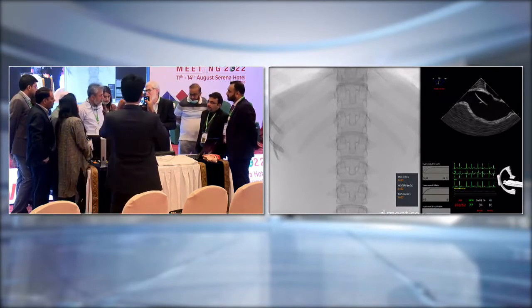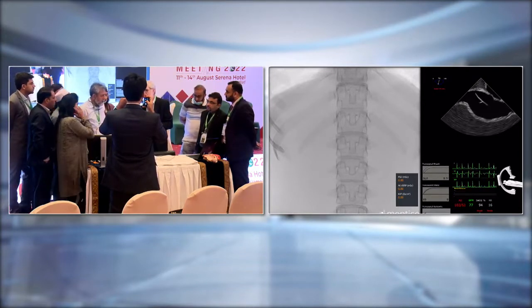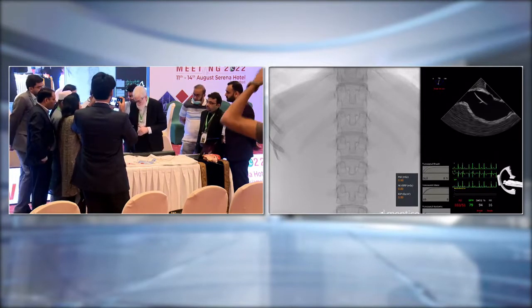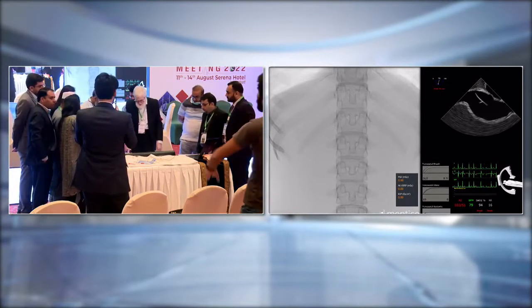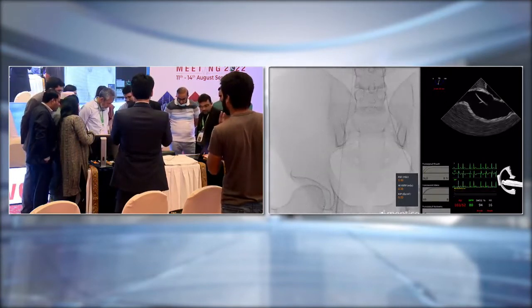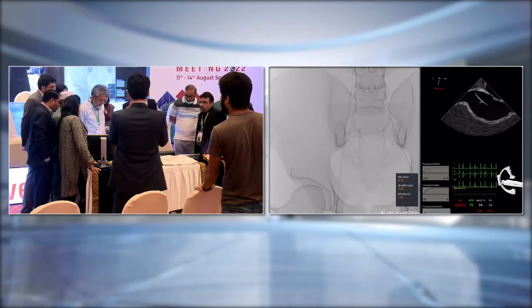I have a presentation on it. Probably in the next session I will do some troubleshooting and the way we function. That's another. So the first thing we do here, you all concentrate here. This is the fluoro, this is the cine, like in real life. Okay. These are the things.